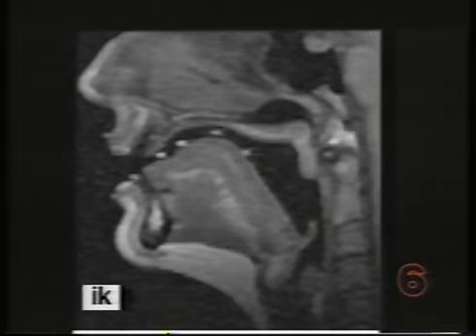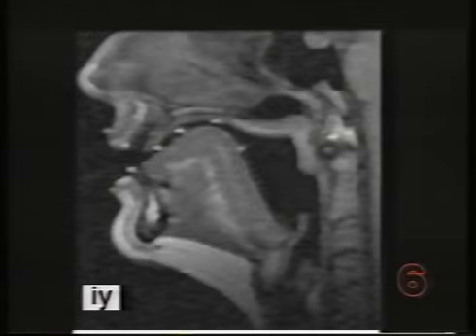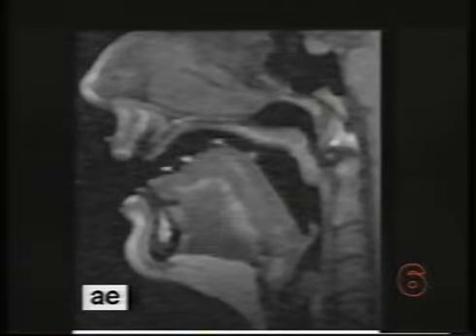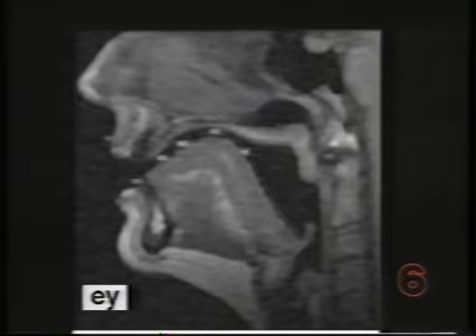These area functions are then used to generate the acoustic signal for a given utterance. Data have been collected on movement and MRI for the same utterances for the same speaker. This allows comparison of the articulatory movements and acoustic signal collected for these utterances with modeled utterances in which the measurements from the subject's own vocal tract is used for simulation. The pseudopellets are crucial for relating the two types of data, movement and vocal tract image.